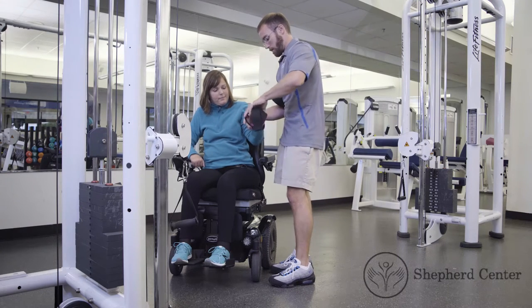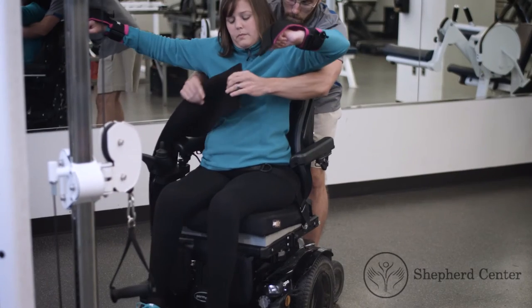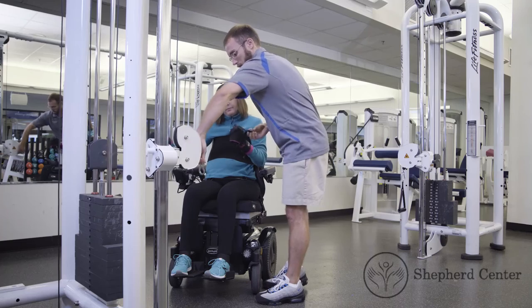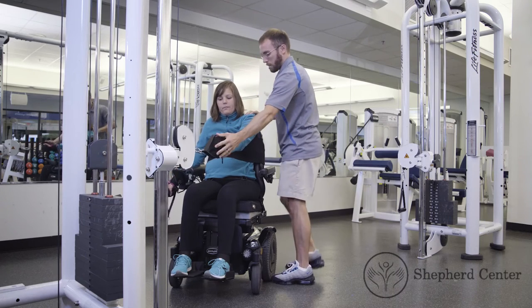Use an assistive grasping device to help the participant with the exercise. Use a trunk strap to secure the participant's upper body to the wheelchair. Attach the handle of the cable pulley to the participant's hand using the assistive grasping device.